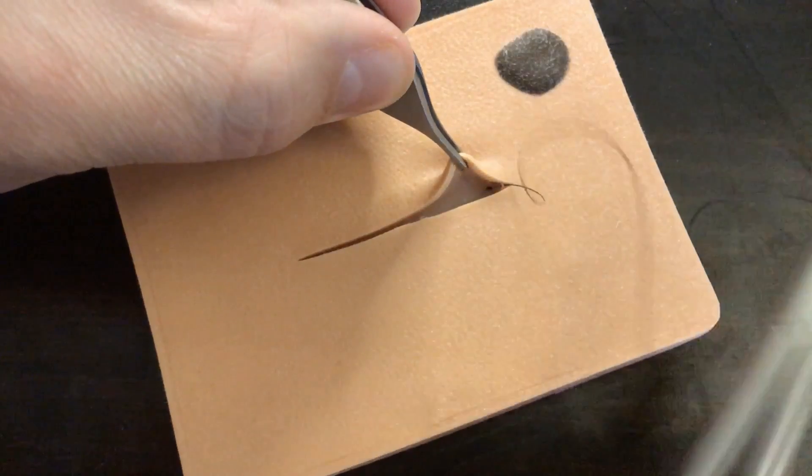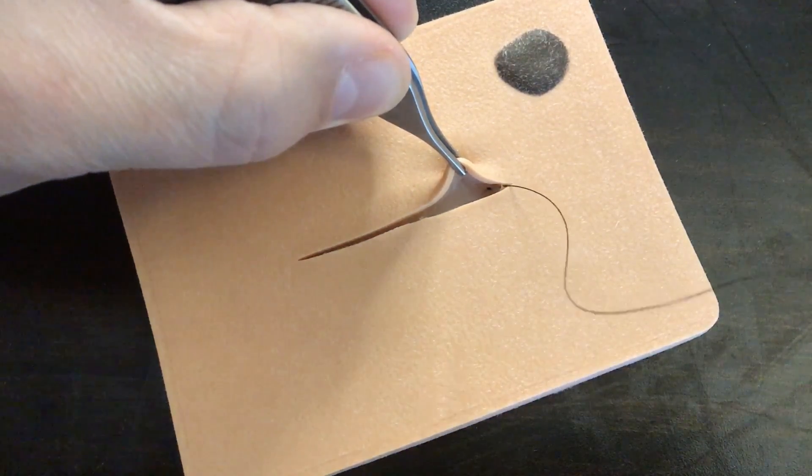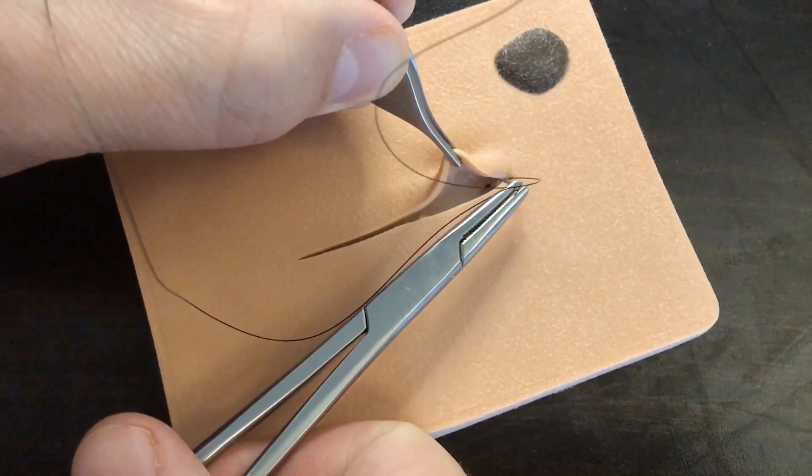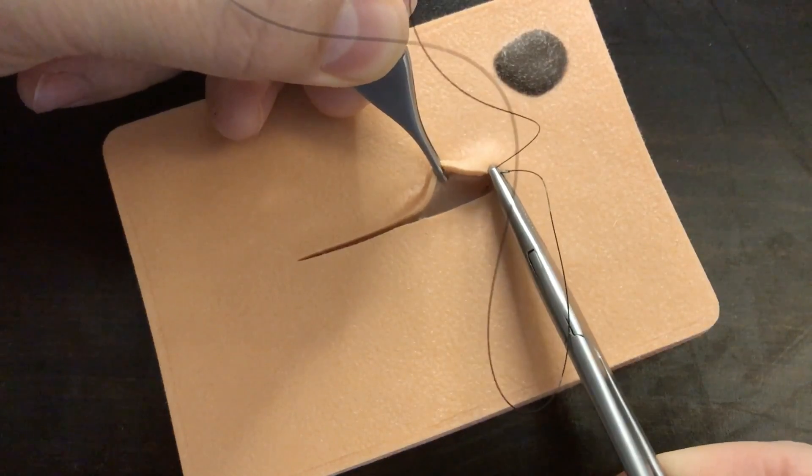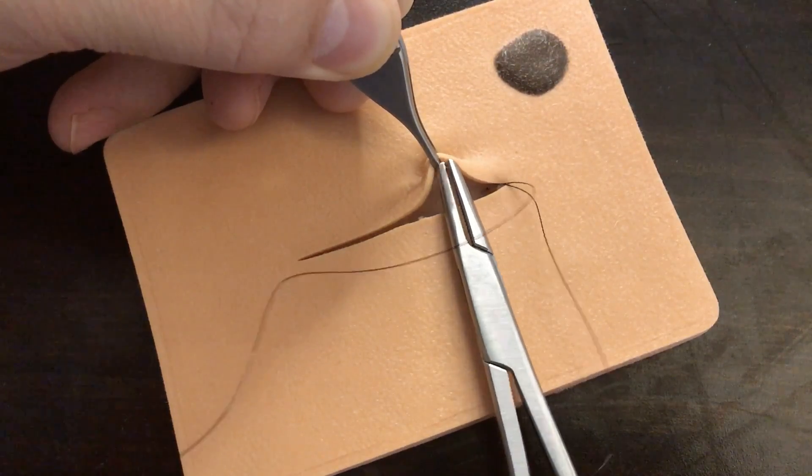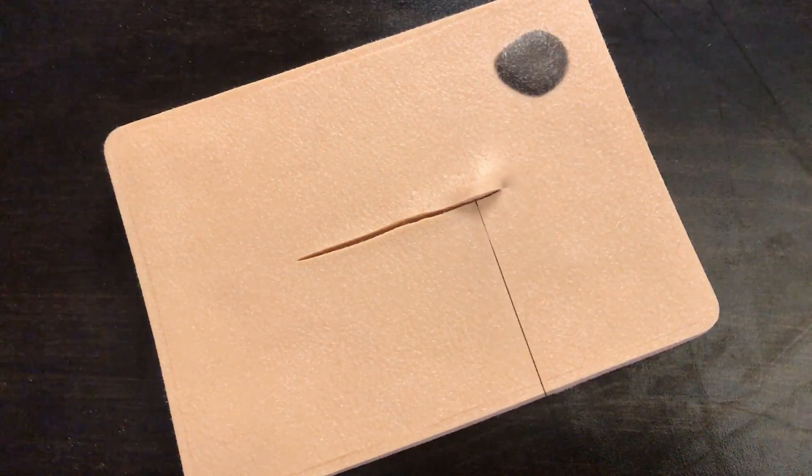So next, first step here, then after I've got the suture there at the apex of the incision is to enter the skin in that horizontal plane, very superficial, being careful not to buttonhole and exiting again, very superficial. I'm going to disconnect, come grab the needle and pull it through.